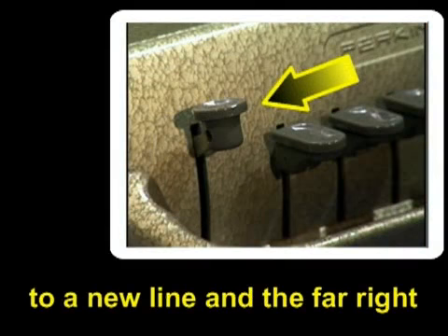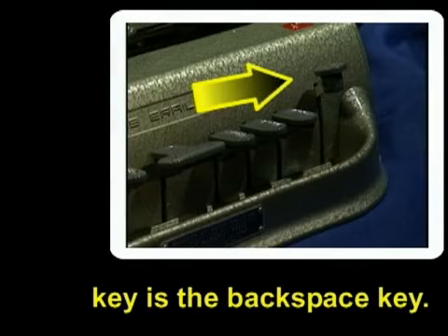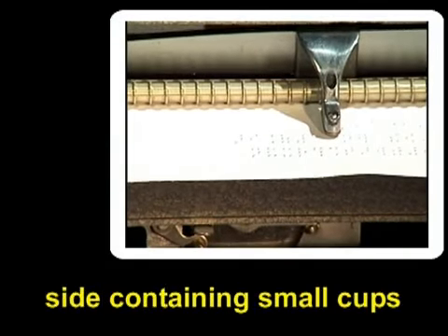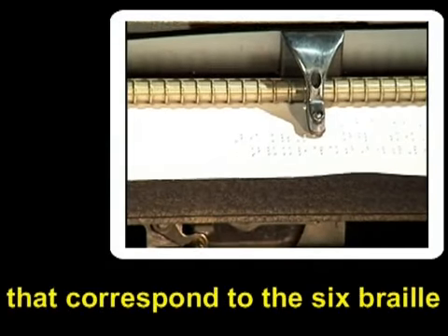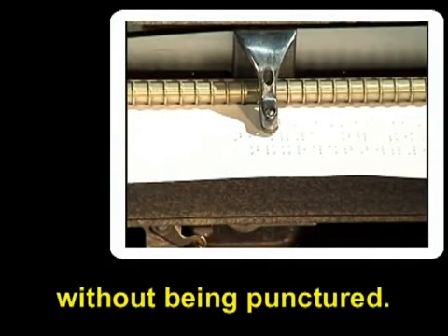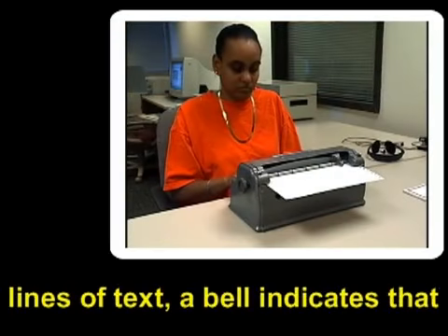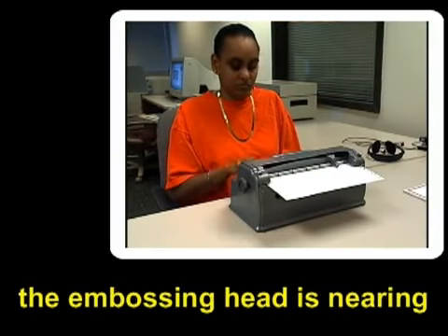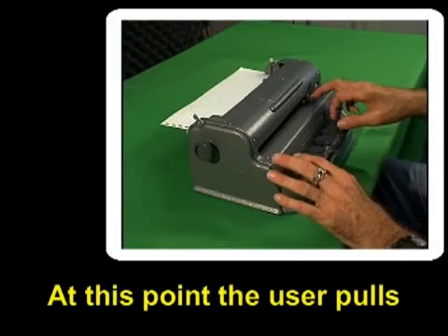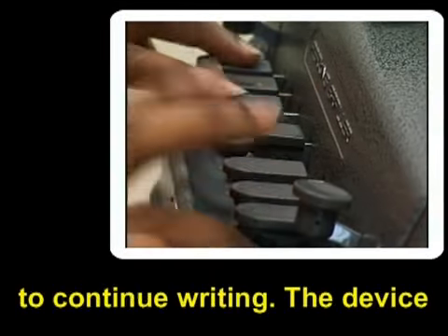The key on the far left is used to advance to a new line, and the far right key is the backspace key. The embossing head has a backside containing small cups that correspond to the six Braille dots, which allow the paper to be embossed without being punctured. As the user embosses lines of text, a bell indicates that the embossing head is nearing the end of the line. At this point, the user pulls back the carriage and advances the paper to a new line to continue writing.